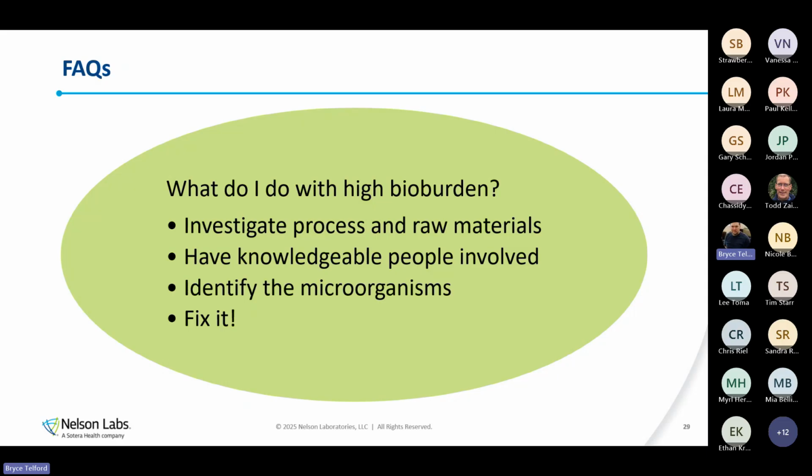So the point of that and the moral of the story is make sure you have people involved throughout the investigation that understand what is happening with that product and why that matters, so that you don't have a whole lot of additional testing and then me asking at the end, so here in your chart it says you have water, even though you've been very insistent for the last several weeks that there's no water. Nobody wants to have that experience. Nobody wants to spend the money on that testing. So make sure that the right people that know what's happening with the actual product, not just what's supposed to happen with the product, but what's actually happening with the product, are involved in that investigation.